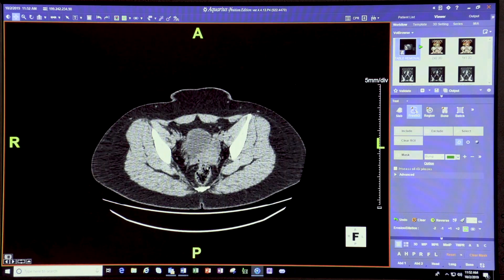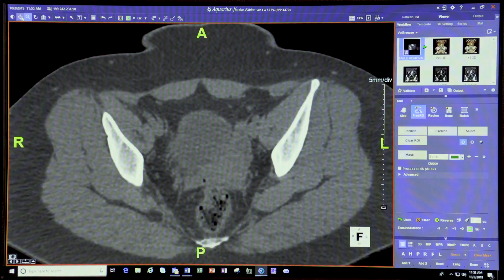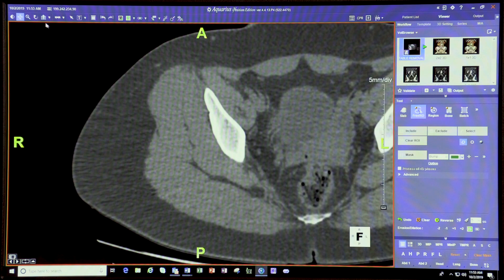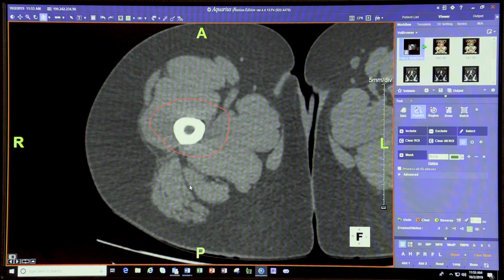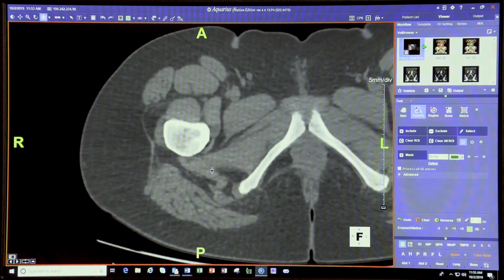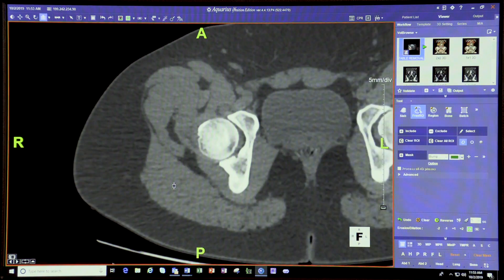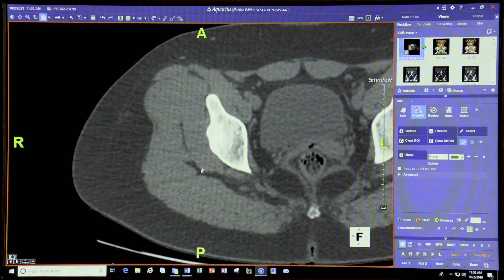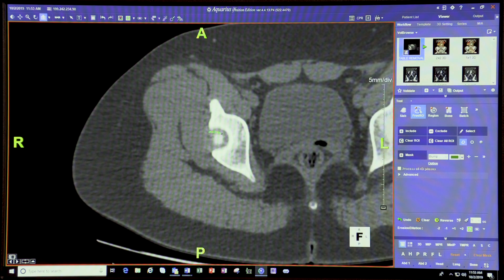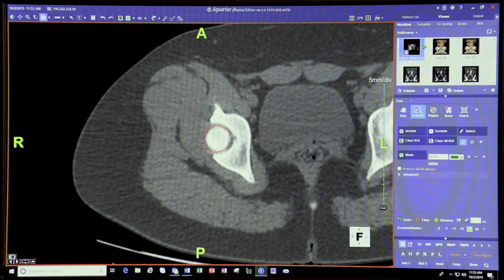In cases where bones are very close together, I change it to bone window and magnify that area to focus on the right hip. Using the scroll button, I scroll through it, then use the shift key with free ROI and left-click to draw a circle around the bone. This is semi-automatic rather than completely manual. We can go to a larger area of bone where it becomes more oblong, get that bone, then go to a smaller circle as we segment the femur. The first circle shows up and as you scroll, it automatically interpolates and captures that femur.